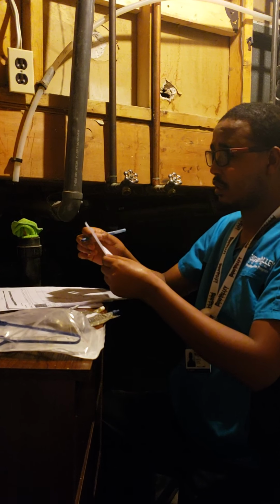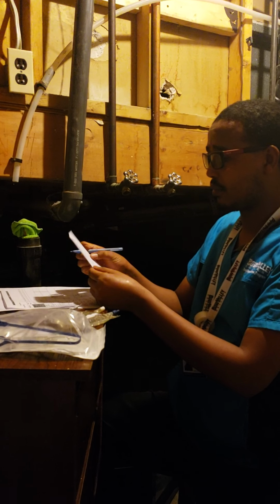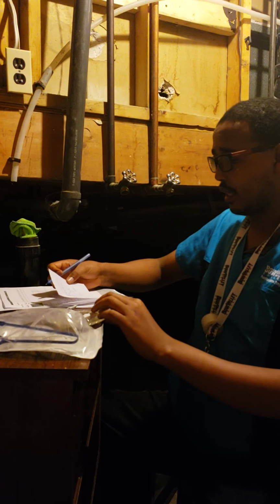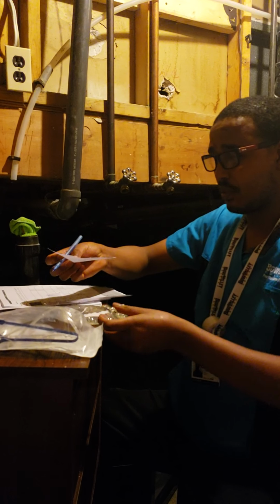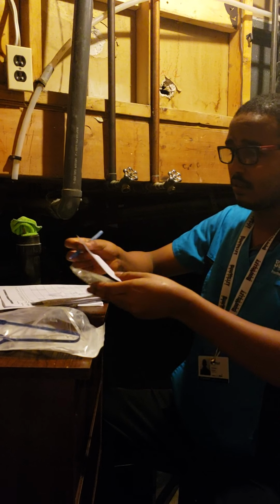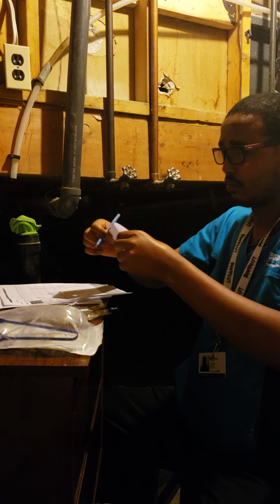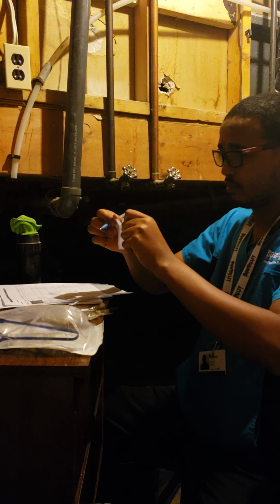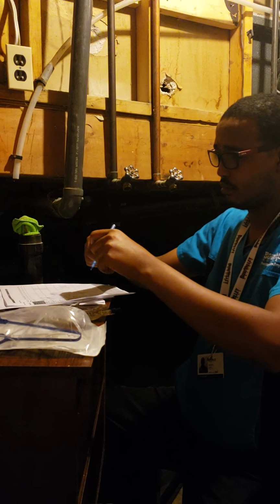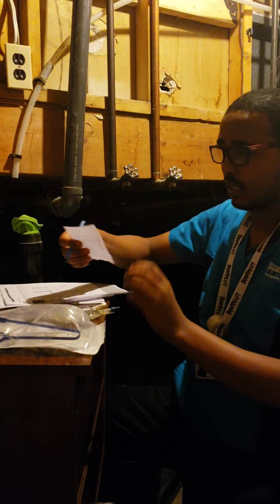Okay, so I've written down dexamethasone 8 milligram IV piggyback and dates. Then I have to stick it to the cleanest side. So this is the cleanest side.